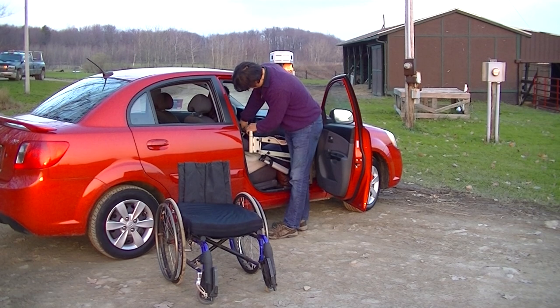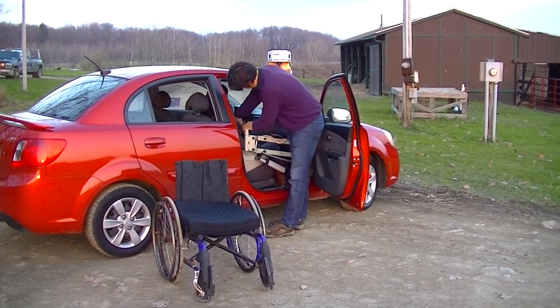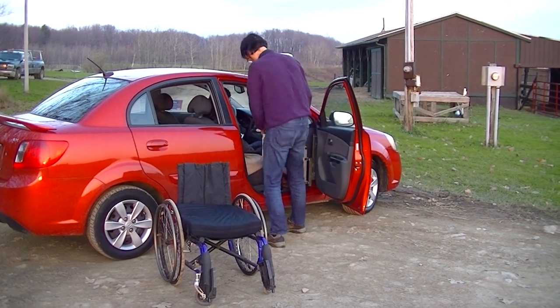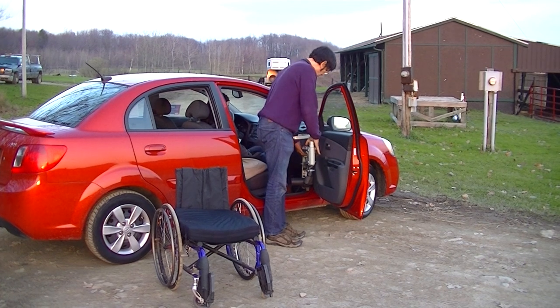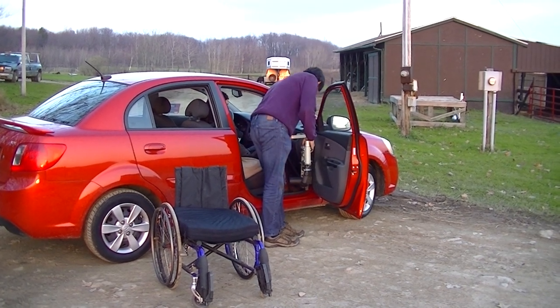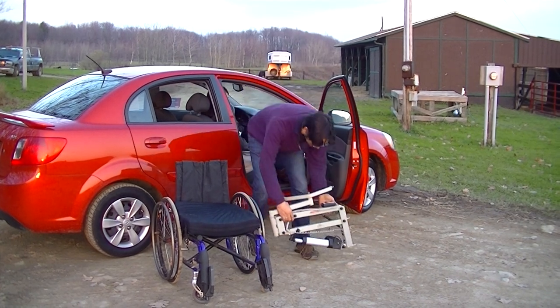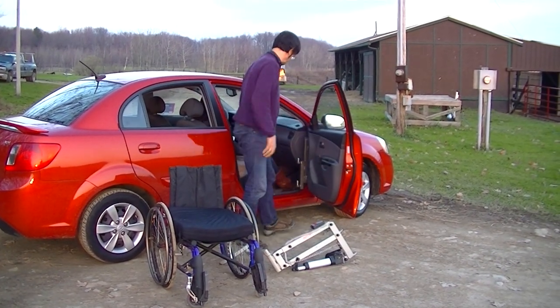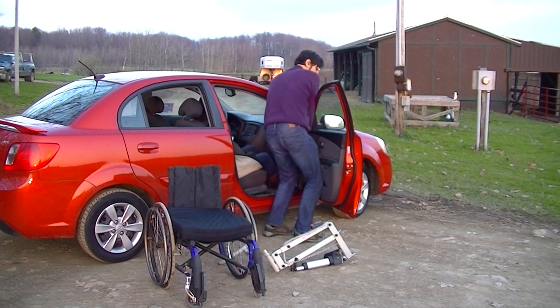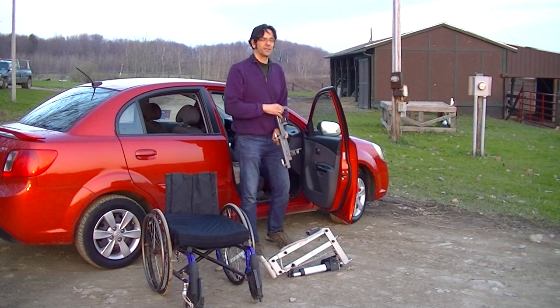Once we're down, we disconnect the sling. Removing the lift is a cinch — we disconnect the power. A little pressure on the door, remove the Speedy Bar, and away we go.